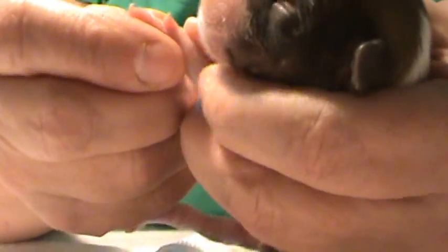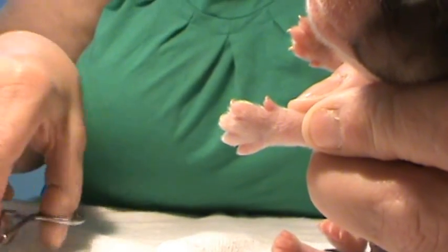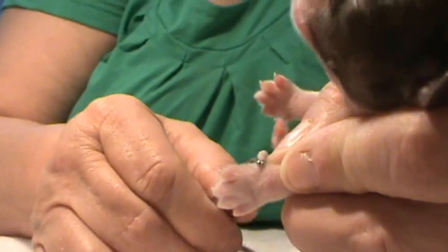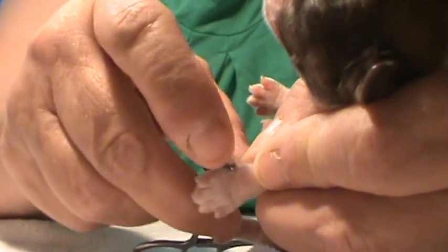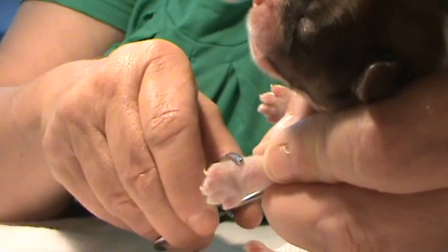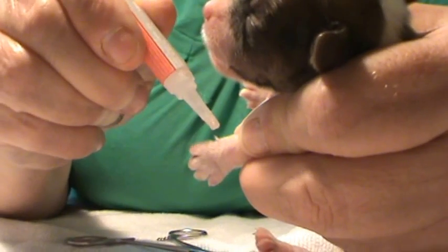Here's another one. You can see the dewclaw — you go in with the curved one, pinch right inside to detach the bone from the leg, and you just push it. Then apply a little piece of crazy glue.